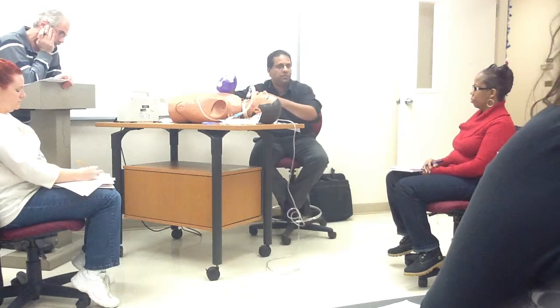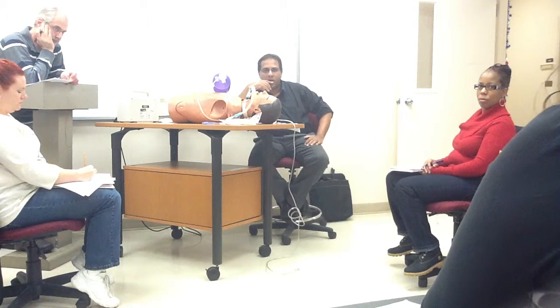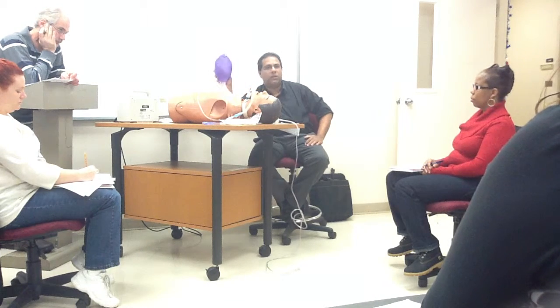If they're on room air, when you come into the room and you're going to suction them, absolutely, you have to hyperoxygenate. Okay. His question is interesting. He's saying 98, 99 sat level. I would think yes, you need to give them more oxygen.